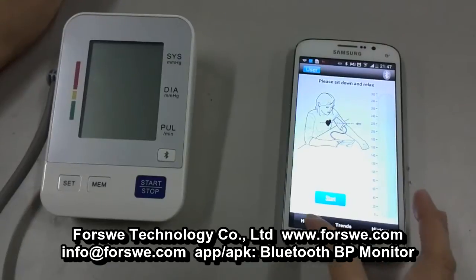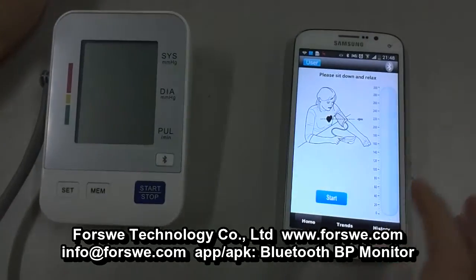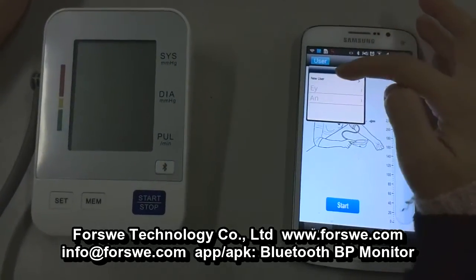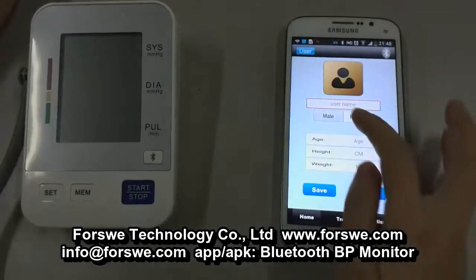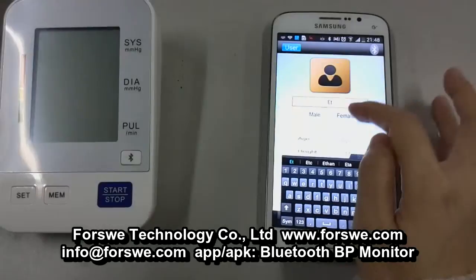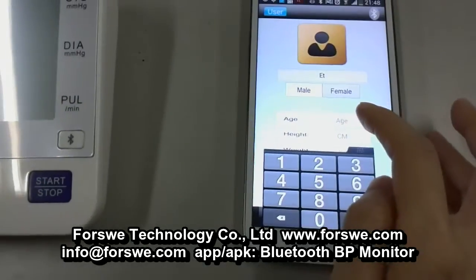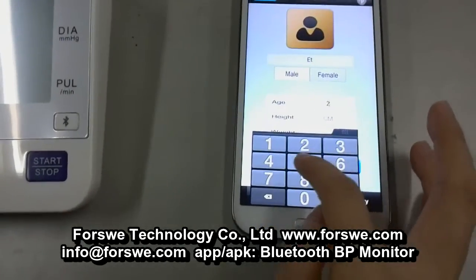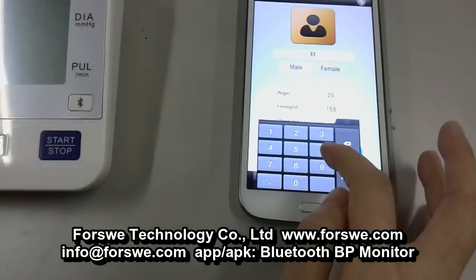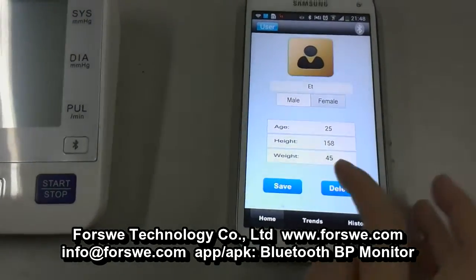Now navigate to the home page. If you don't have a user account, you have to create a new one. Press the button 'User' and choose 'New User'. Input your name, then choose the sex — female or male — and enter your age, height, and weight. Then press the button 'Save'.